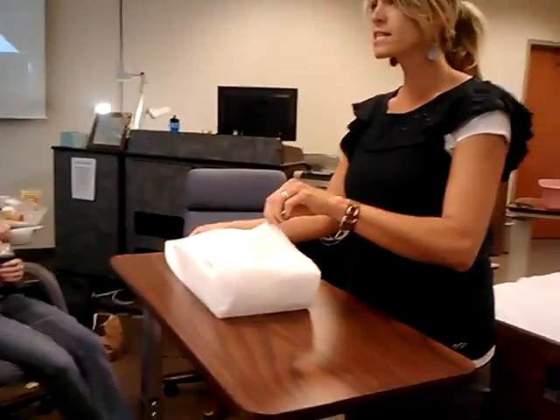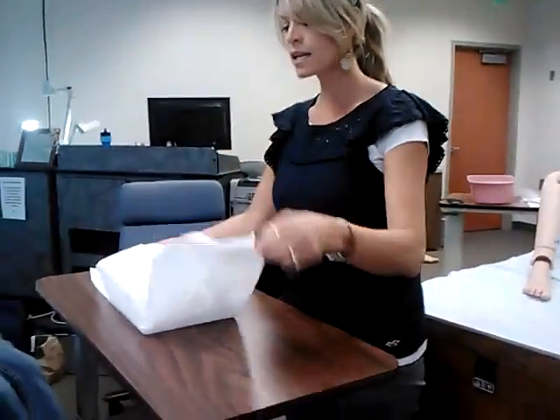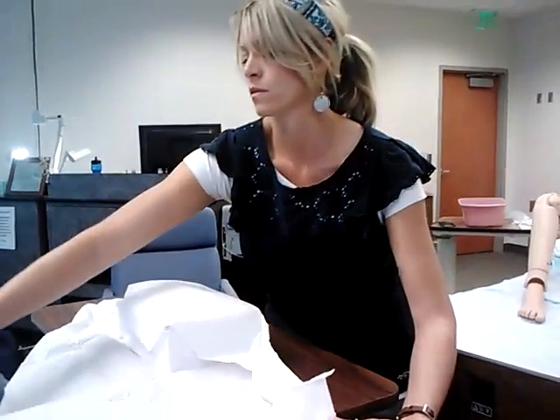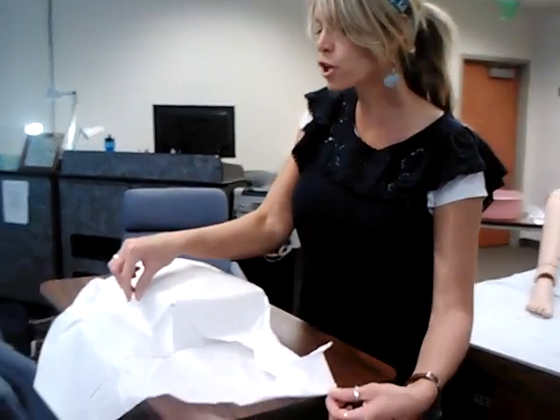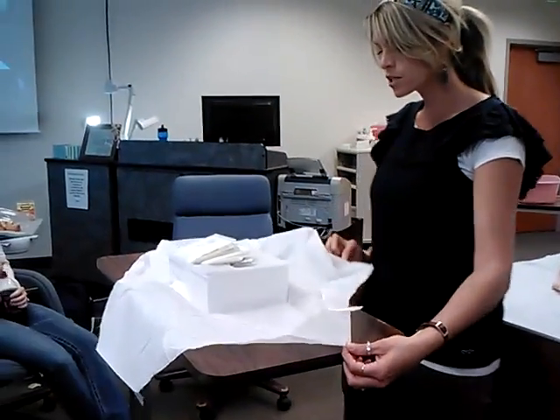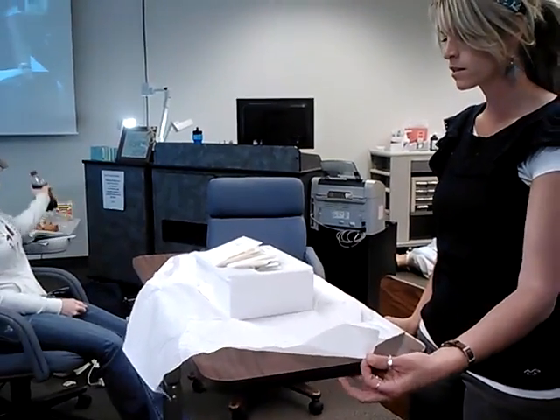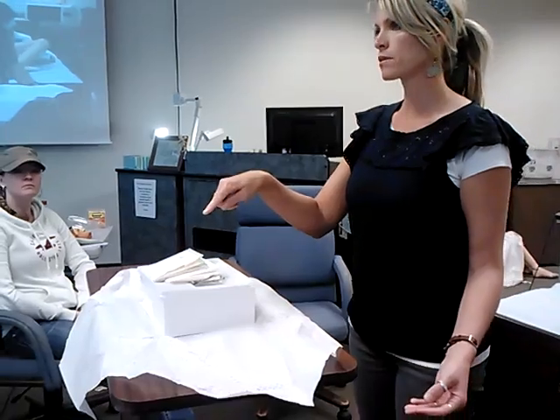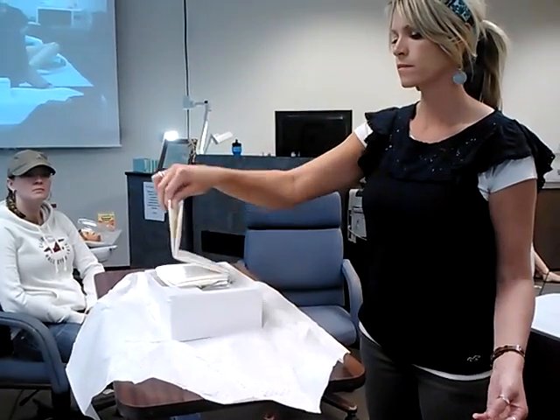Go. Okay, so this is how you set this up. So you go side, side, away from you, and then towards you. Always picking just the corners. Your gloves will be directly on the top. So you will get your gloves.